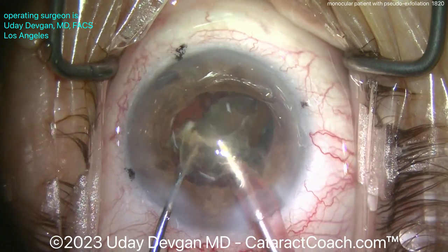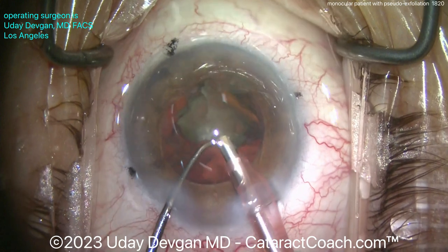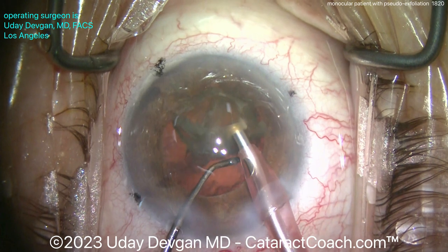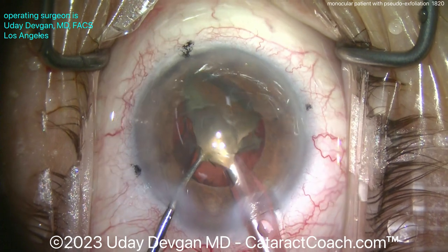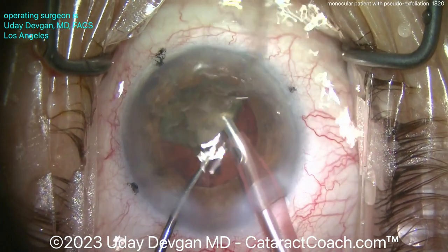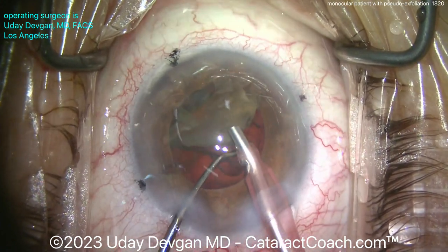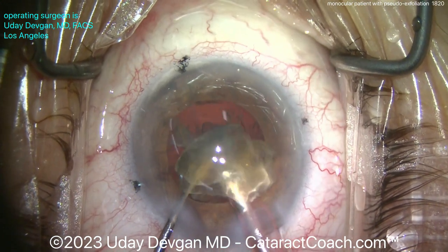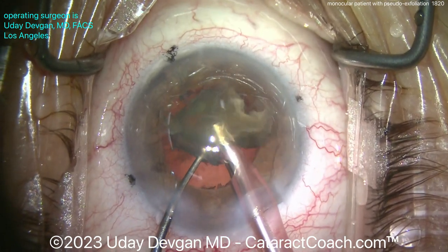Taking on this nucleus nice and easy — remember you've got to protect that capsular bag, it's extra floppy in this case: 88-year-old patient, pseudoexfoliation, the works. If the capsular bag breaks, you can't even put the toric lens in the eye. The toric lens for two diopters of corneal astigmatism has to go in the capsular bag. Notice the position of my chopper — smooth end down just to protect the capsule — going nice and easy, taking these pieces down.